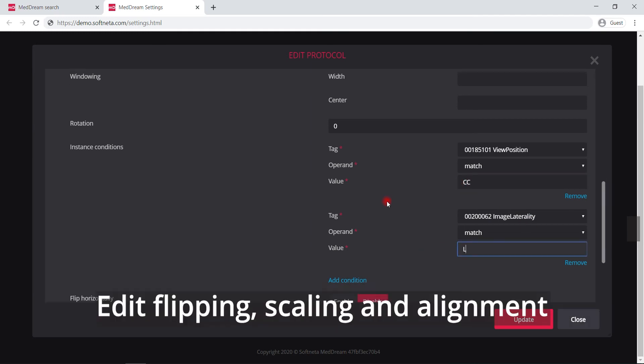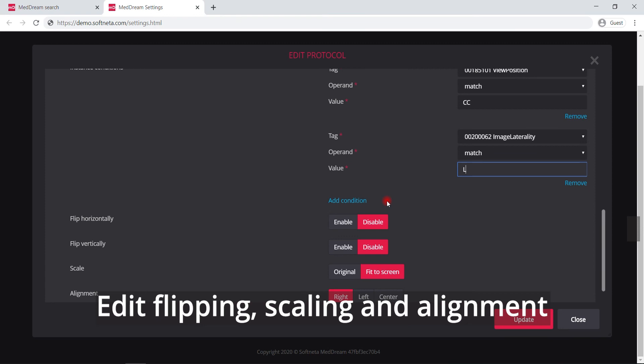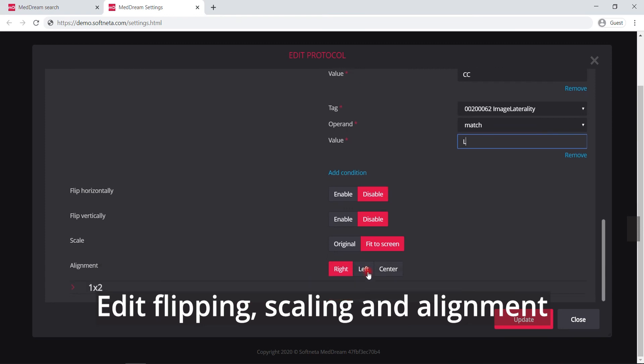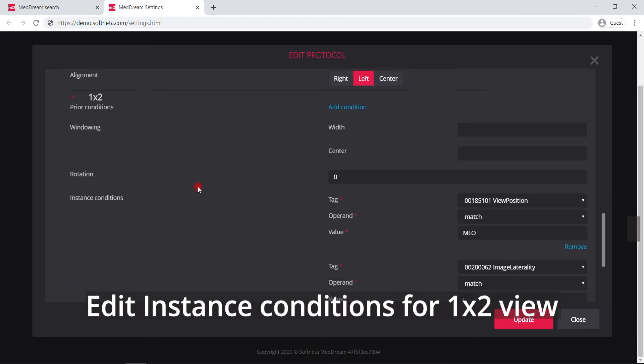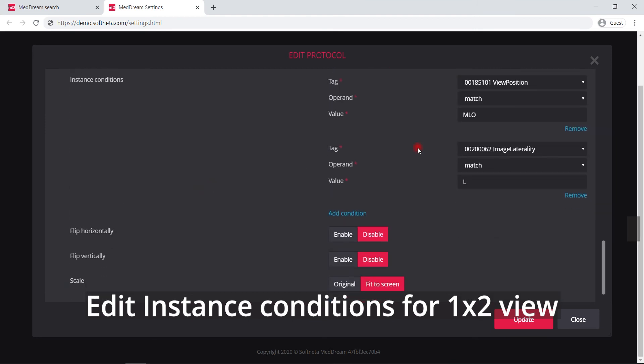Change rules for image display, flipping, scaling and alignment. Edit the instance conditions for one by two view if needed.